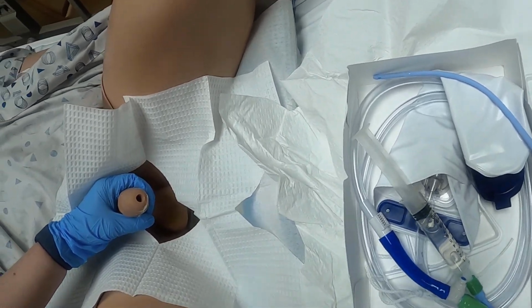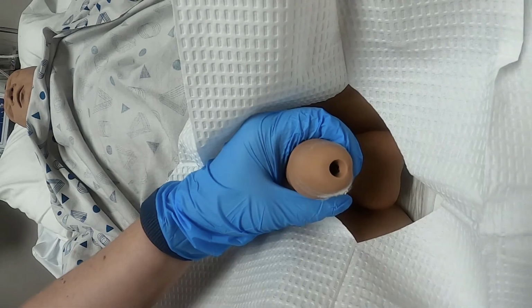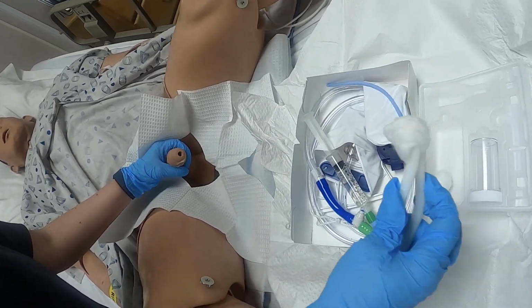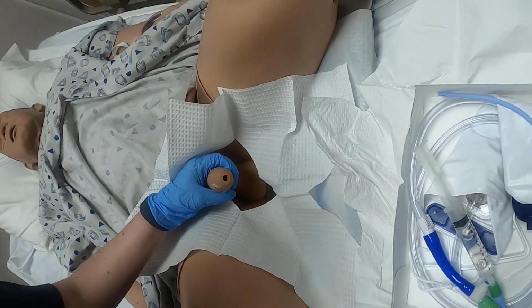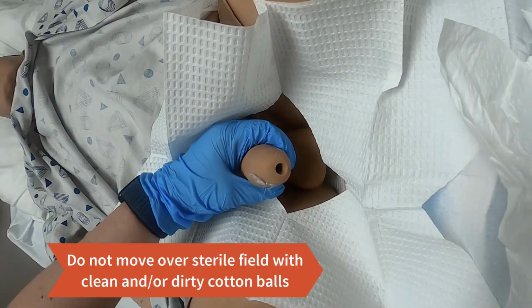Next one, top, and the trash. And you use all of them. You don't just stop once you think that it's clean. And the trash. Last one, top, and the trash.